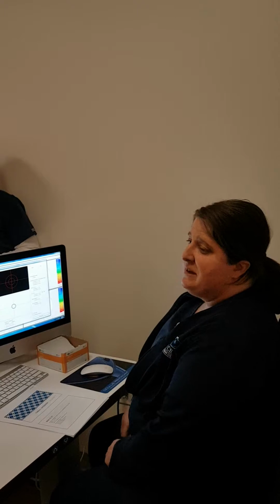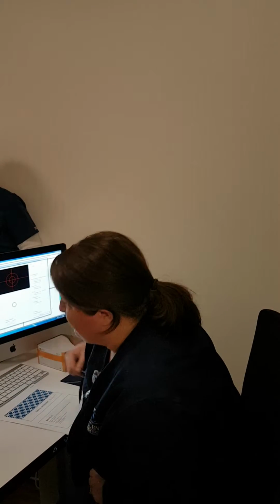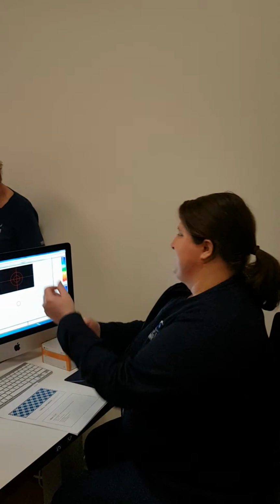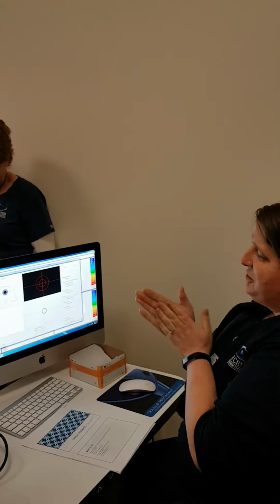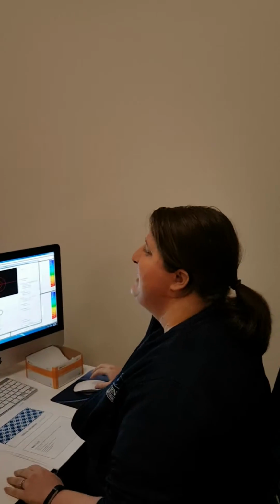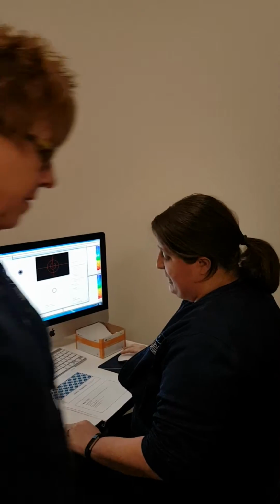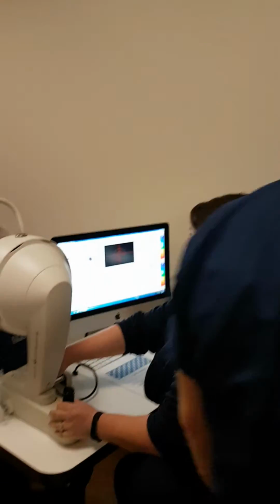Machine, does somebody want to be a volunteer for me? Okay, great. Can you get her chair? Thanks. All right, lovely Joanne. Thank you. So a good one would be appreciated at first, just so I can explain what I'm doing.